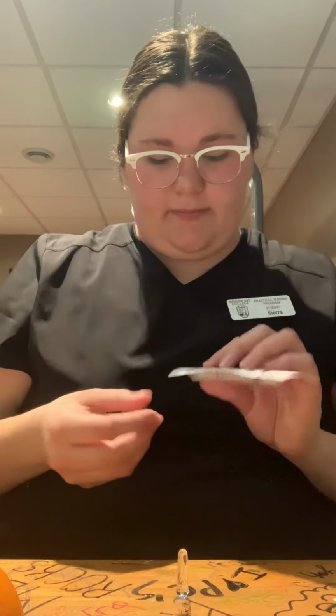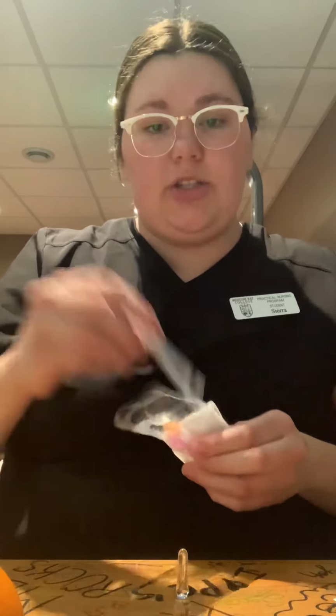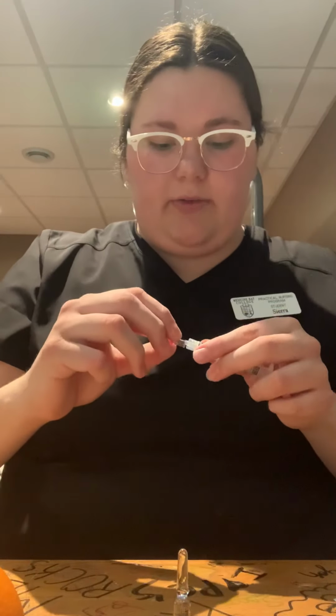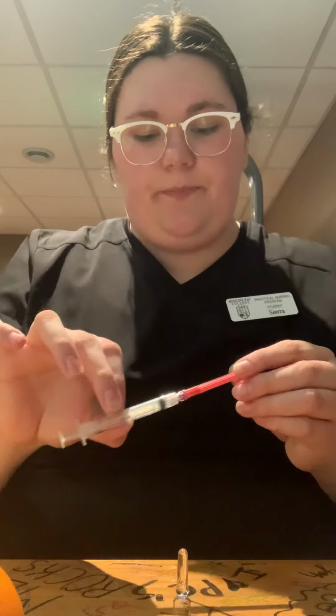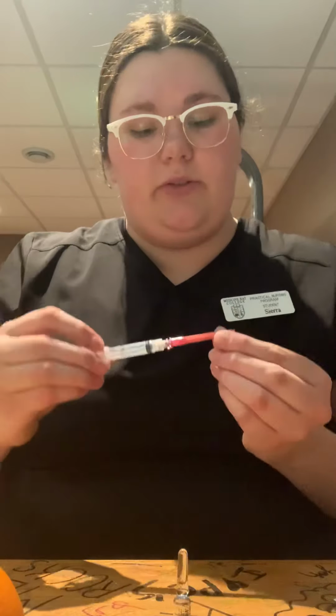While that is air drying, I will prepare our needle and our filter. So we're going to open the package, just grabbing our plunger at the time, and then grabbing our blunt needle filter, and we are going to twist this on and have it ready to go. Again, we need a filter needle because we want to make sure we are filtering out any glass shards that there may be.